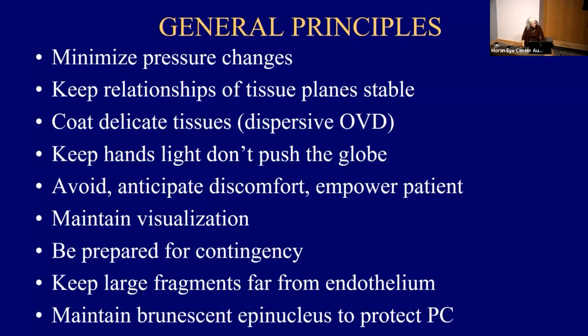We want to maintain visualization. Of course, we'll use Triesence in a vitrectomy situation appropriately, or we'll use trypan when we don't have a good view. And it's such an important part. One of the advantages, a disadvantage actually, that you young people have is that you can accommodate, so you don't really know where you are in the anterior chamber. As you get older, you know you've got to focus more to be in focus because you're not accommodating. And it's always helpful to be in focus at the place that you need to be working.